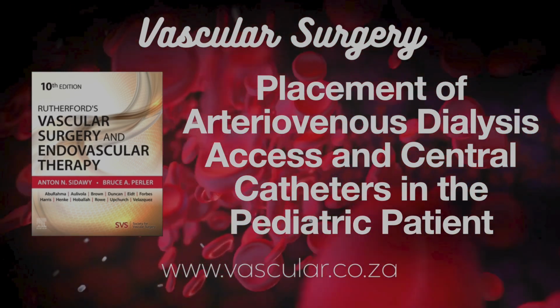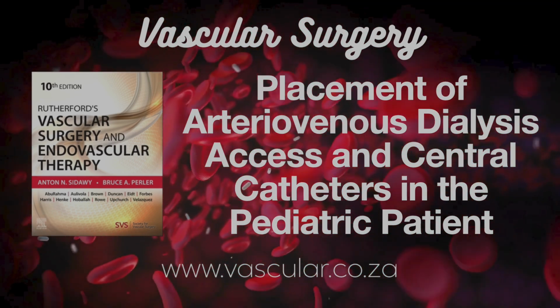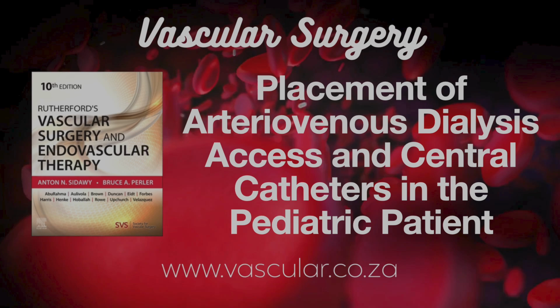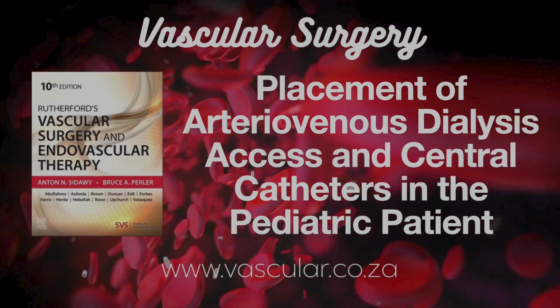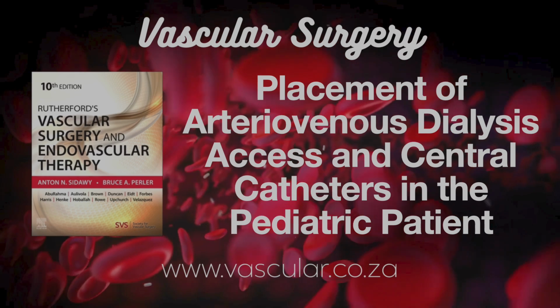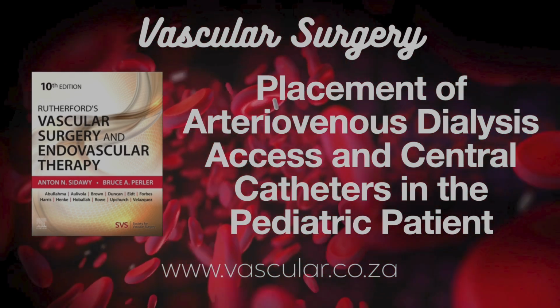Okay, let's focus on HD treatment and the access itself. We know getting good access is priority number 1. The big push for fistulas, the FFBI and IPFFI, came from worries about CVCs, specifically central vein stenosis and infections. Right. Those are the two big CVC bogeymen, really.